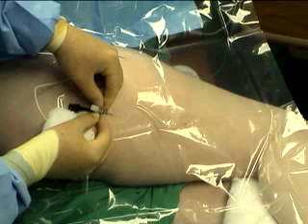Do not inject normal saline or any other conducting fluid through the needle at this stage. The notion of opening up the space with normal saline to advance the catheter is not based on scientific fact, since in live tissue it only infiltrates the tissue, makes it edematous, and makes further nerve stimulation through the catheter impossible or difficult.